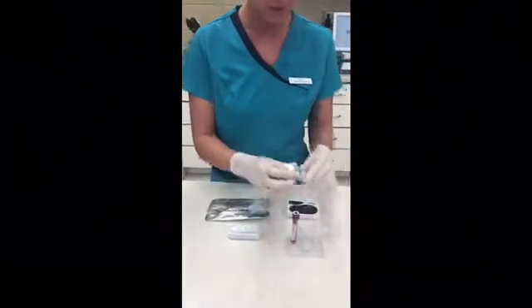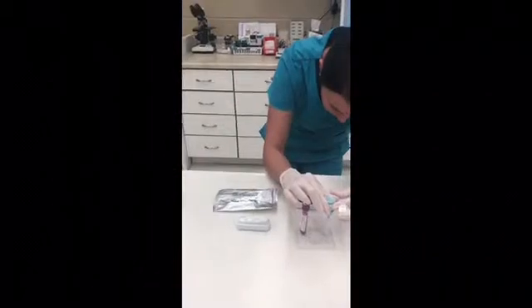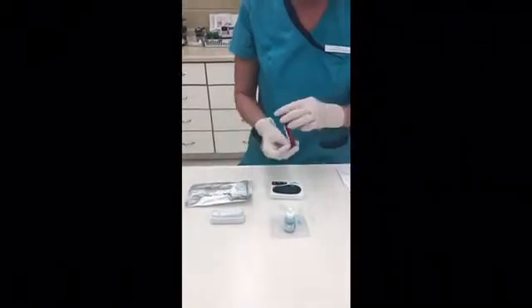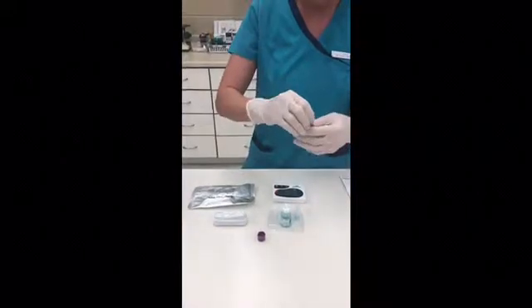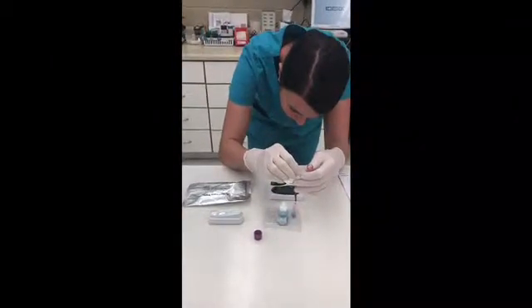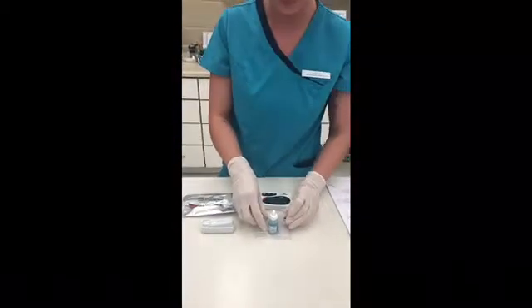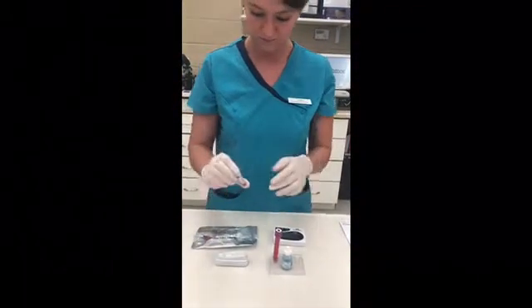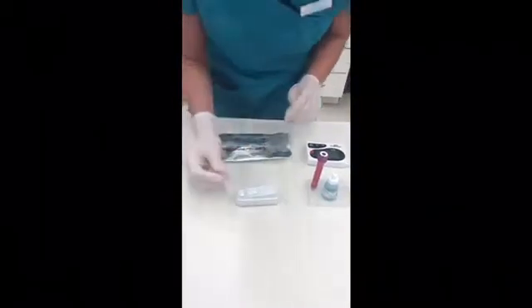So the first step is, according to the manufacturer's instructions, you'll use 4 drops of the conjugate. And then 3 drops of the patient's sample. So 1, 2, and 3. All right, so now you're going to take this tube and invert it 3 to 5 times to thoroughly mix. All right, and then you're going to place it in the sample well here, the entire contents.